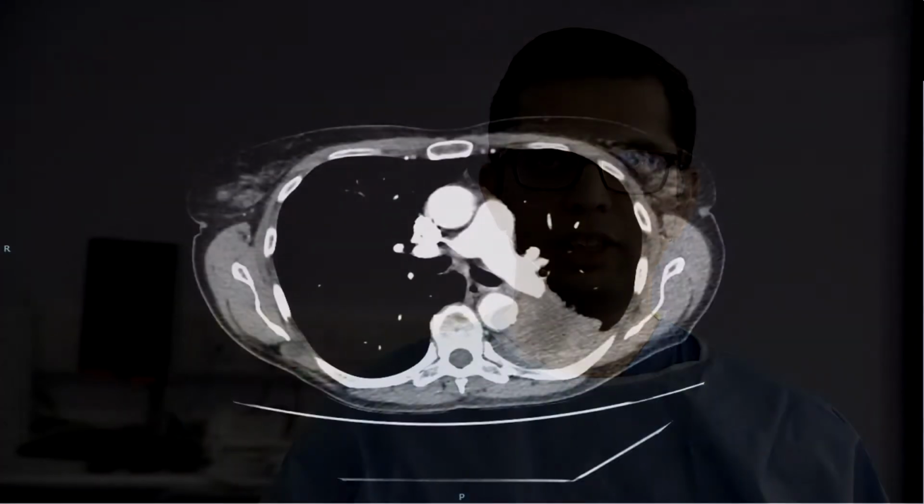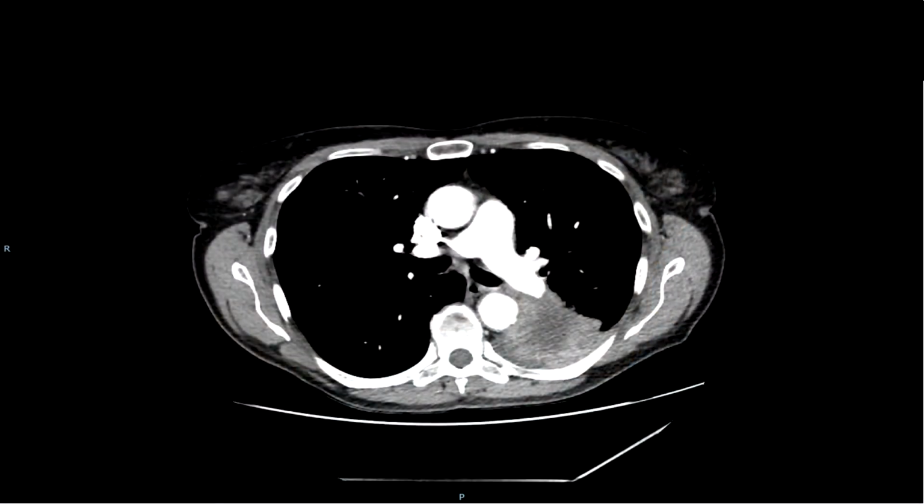Linear endobronchial ultrasound. This case involves a 69-year-old lady who has a 55-pack-year current smoking history. She has been investigated for chronic cough, initially with chest X-ray and then subsequently with staging CT. She has a good performance status of 0 and normal spirometry. Unfortunately, her staging CT showed a left lower lobe mass with left hilar lymphadenopathy. So this procedure will involve both diagnostic as well as staging.